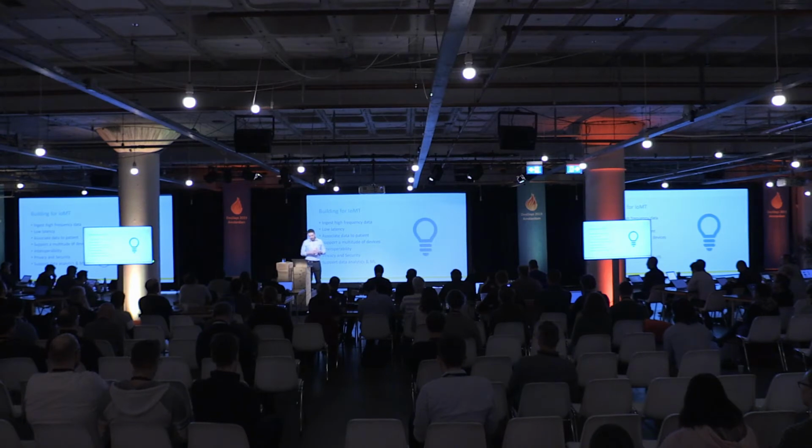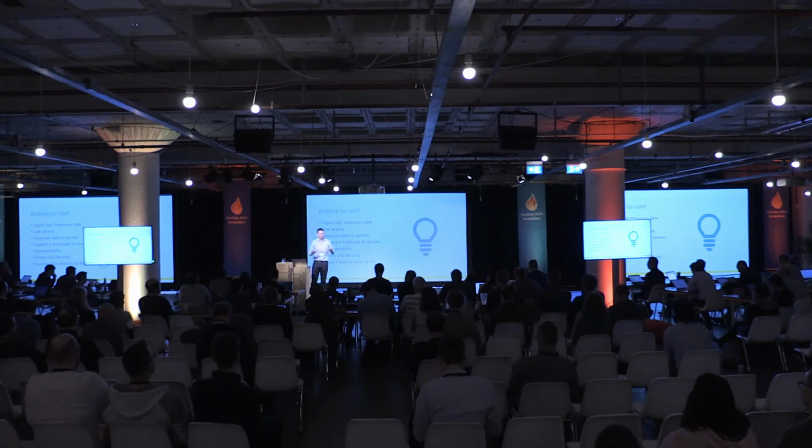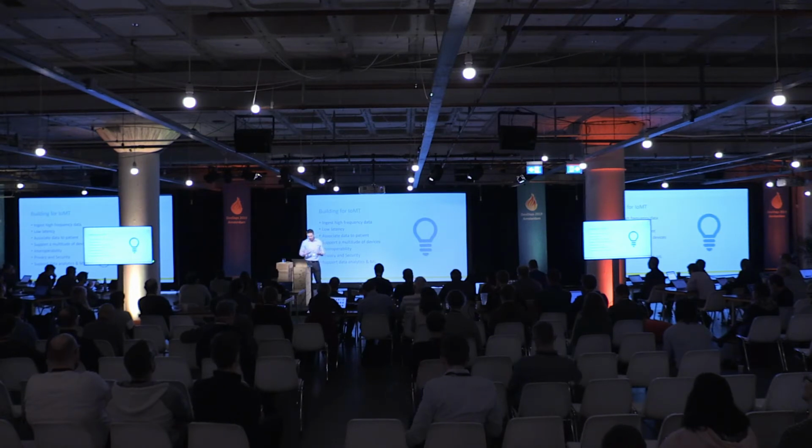Also, if you want to be able to intervene or take action, the data has to be fairly low latency. So it doesn't do any good if you're capturing these high fidelity data sets, but you don't actually see them in your system of record for, say, 24 hours. That really doesn't do any good. We want to be able to associate the data to the patient. We have to have that clinical context, but do it in a safe and secure way.